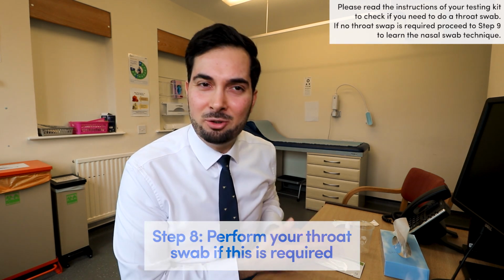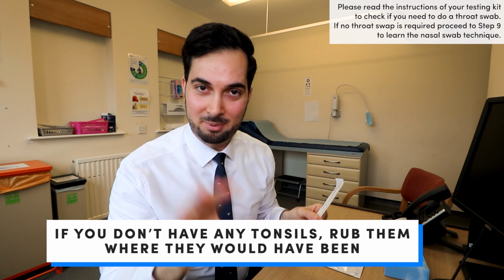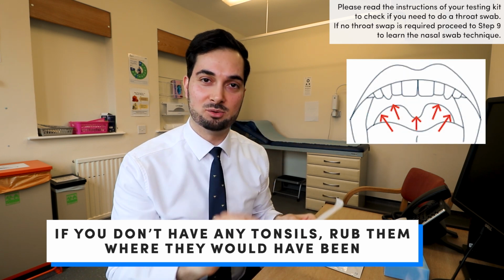So ideally do this 30 minutes after eating food, because if you just eat, you're going to have all that food in there and it might contaminate your results. So it's ideal to do it 30 minutes after food. So to do it, you're going to open your mouth nice and wide, you're going to get your swab, and you're going to rub the fabric end 4 times on each side where your tonsils are, okay? I'm going to have a diagram pop up at some point as well which shows you where the tonsils are.